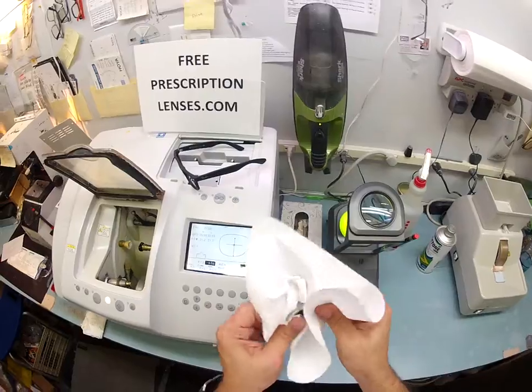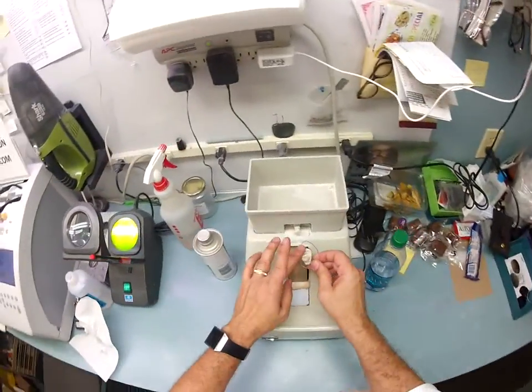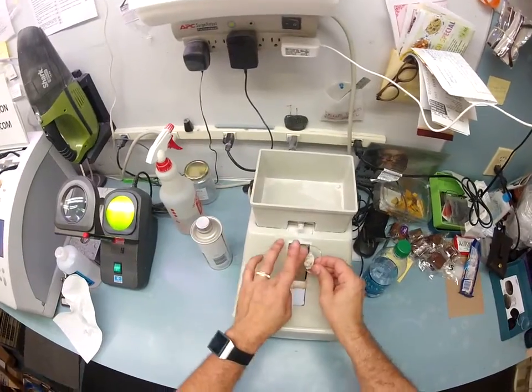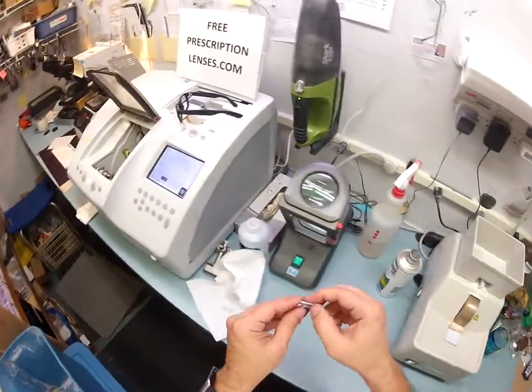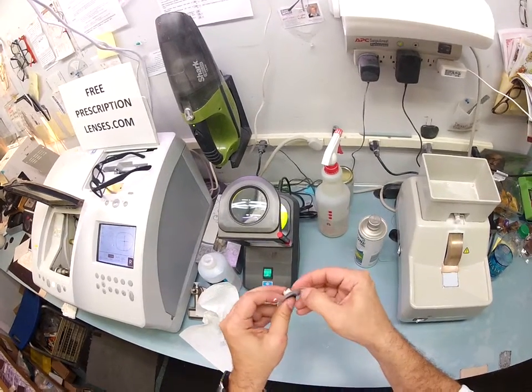Dry your lens off again. With that hydrophobic coating, it's just like when you wax your car and it rains — the rain beads right off. The same thing's going to happen if you use any liquid cleaner on your lens, so it is now obsolete. You never have to use liquid to clean your lenses. Just the cloth will suffice.